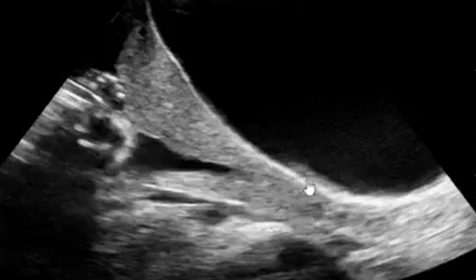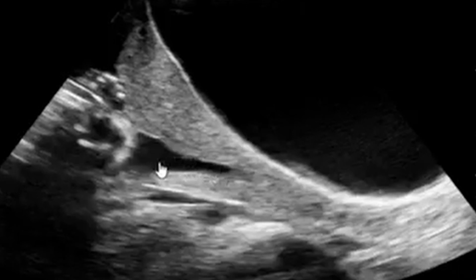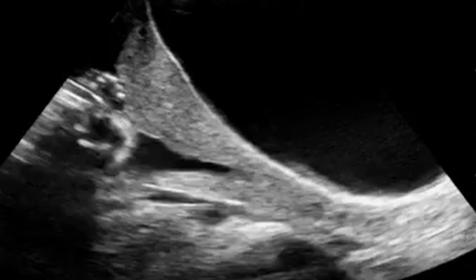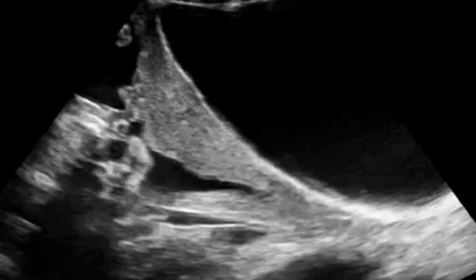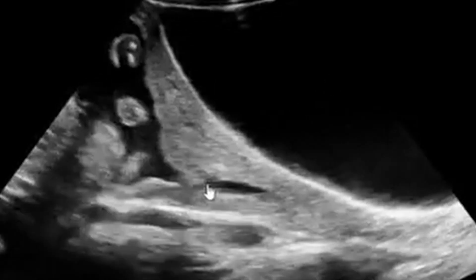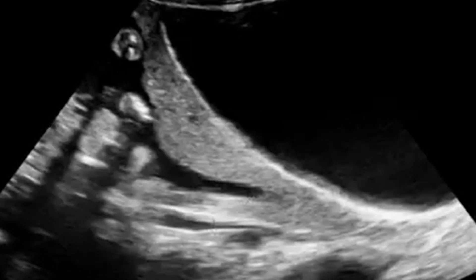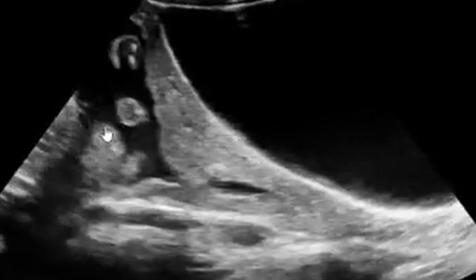We don't need this to happen here because this can actually cause a miscarriage. Appreciating it again, you can actually see that the OS is open here, all the way up to here. The OS is open, and then this is our fetal head which is coming in somewhere there.